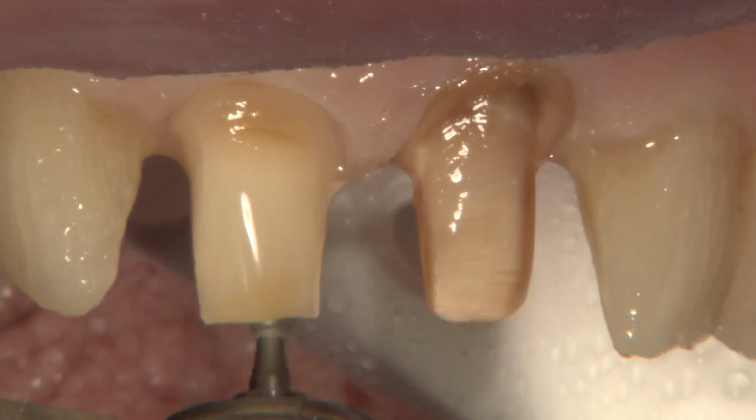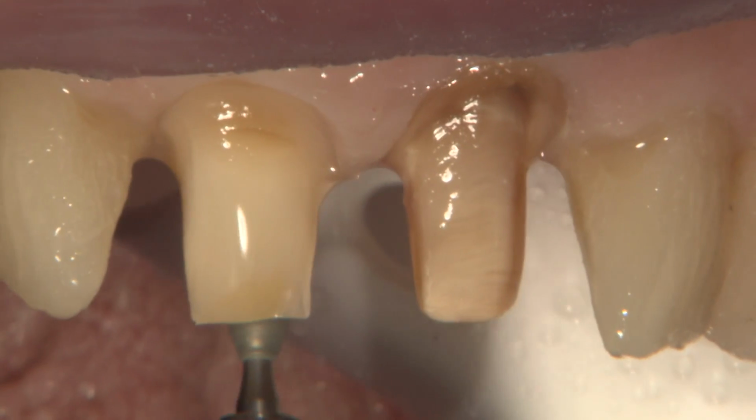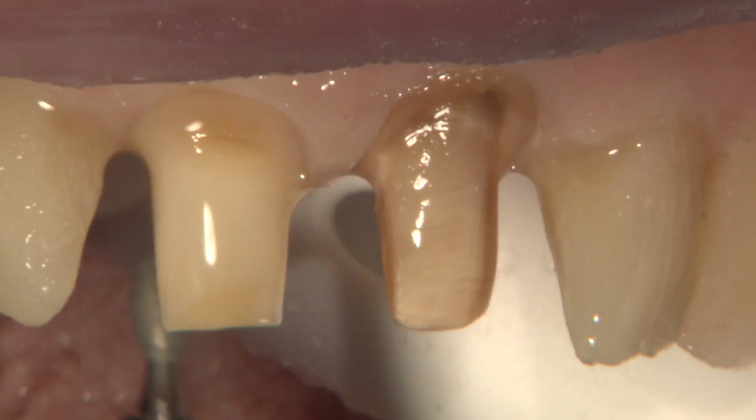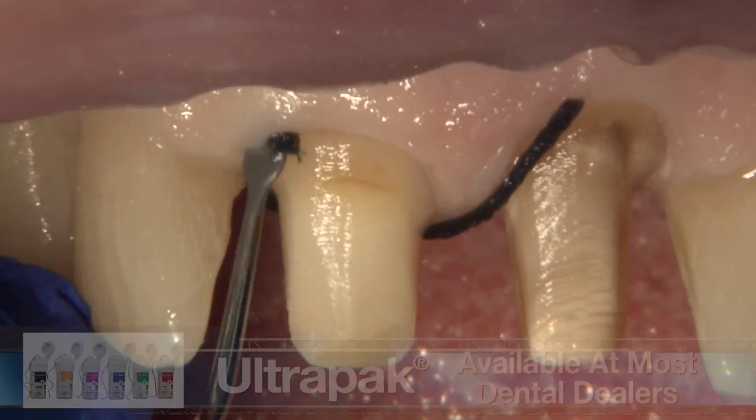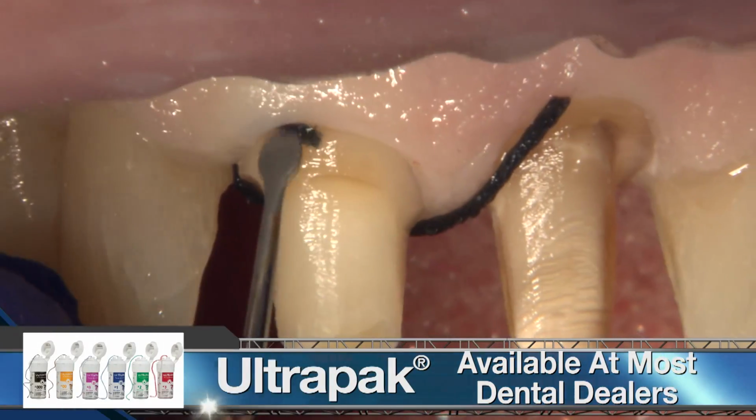Now I'm using a football diamond to reduce the middle and incisal thirds of the lingual side and also to round over any sharp internal angles. For the gingival retraction, we are going to use a dual cord technique.